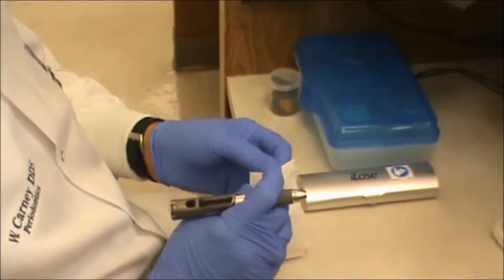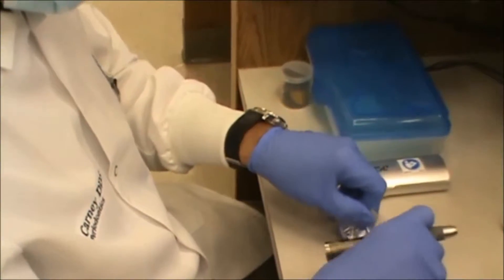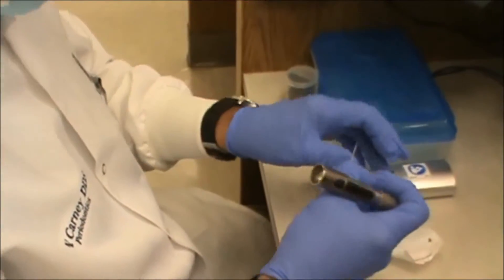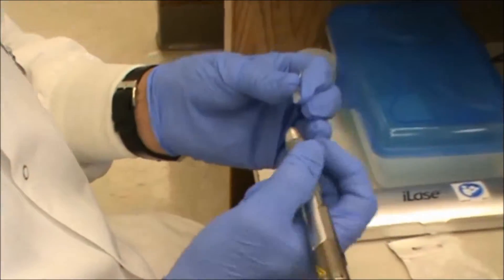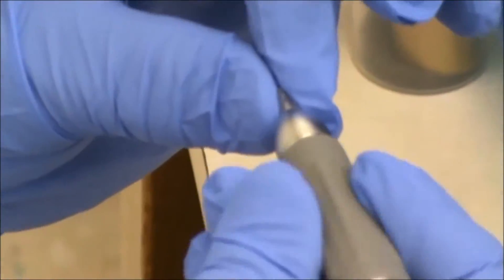Next, we want to place a disposable tip on the laser. It should be disposed of in the sharps container when you're done. Simply screws in to the front.